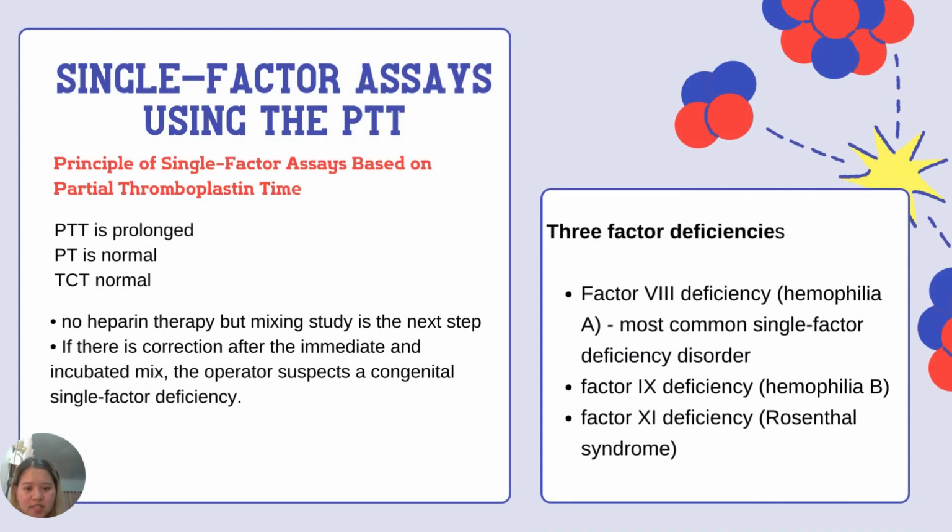So next, the single factor assays using the PTT. Principle of single factor assays based on partial thromboplastin time. If PTT is prolonged and PT is normal, TCT is normal, no heparin therapy, but mixing study is the next step. If there is correction after the immediate and incubated mix, the operator suspects a congenital single-factor deficiency.